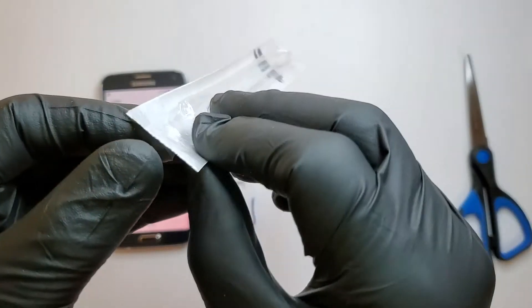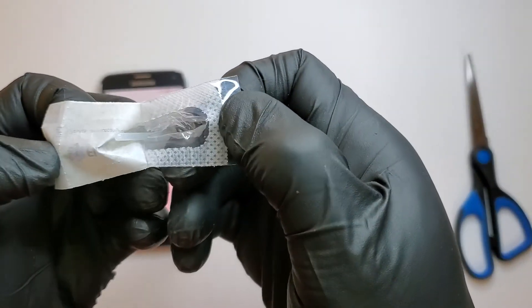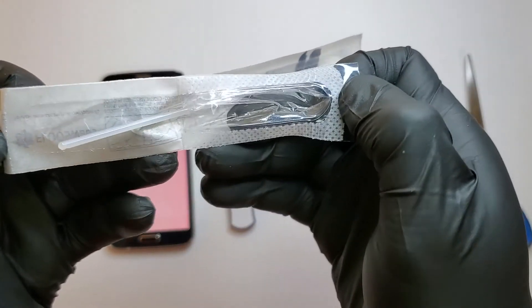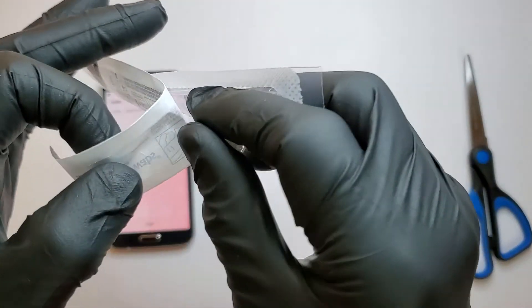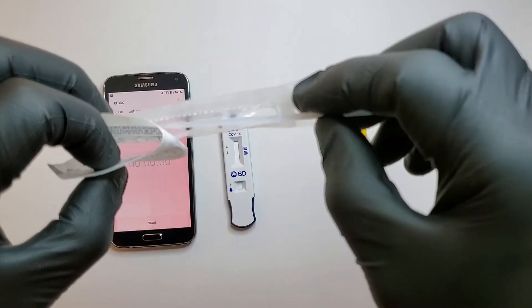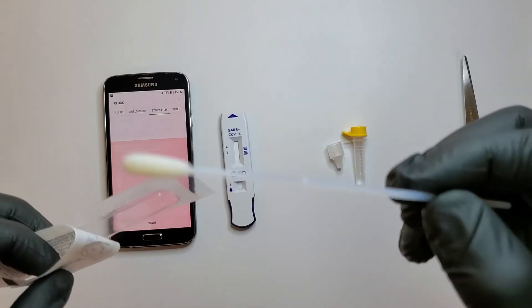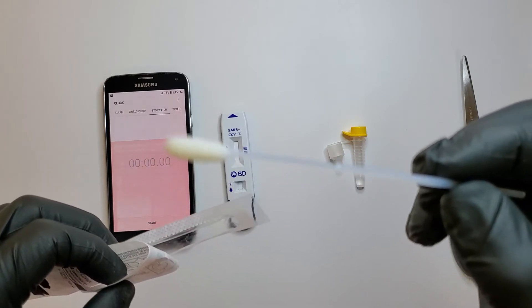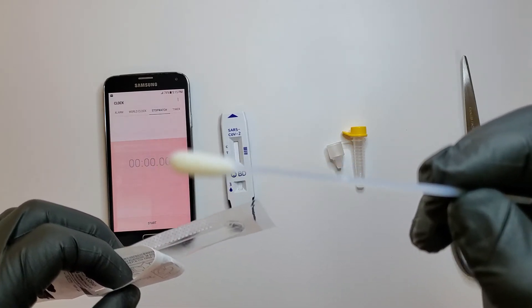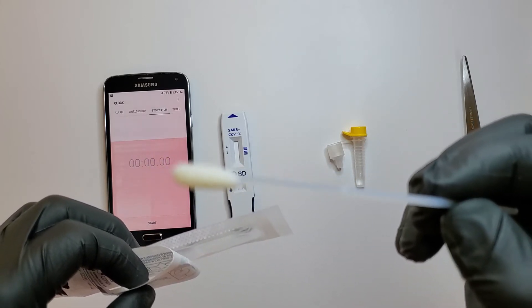The first thing I'm going to do is open the nasal swab. I'm going to take it out — nice and clean. Now I'm going to go swab my nose. Let's go.